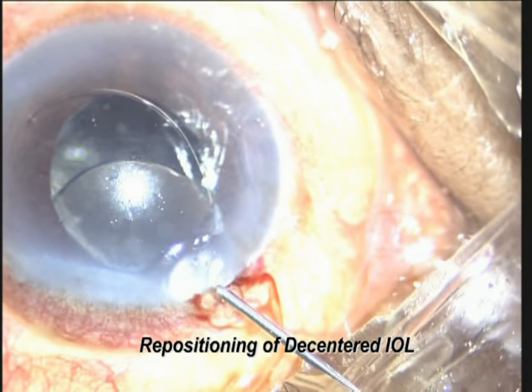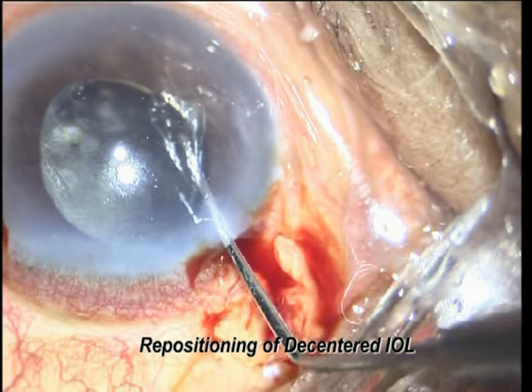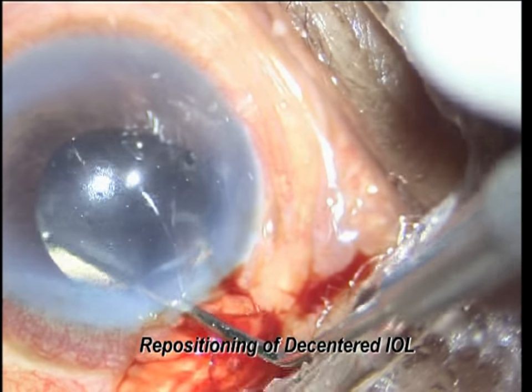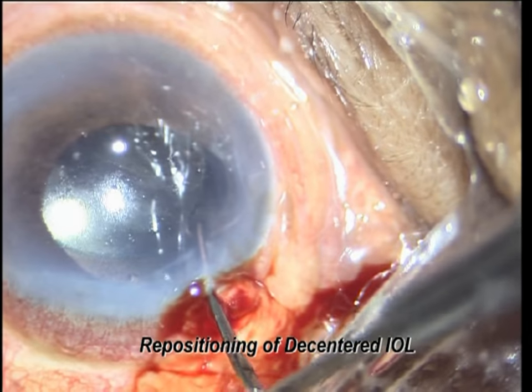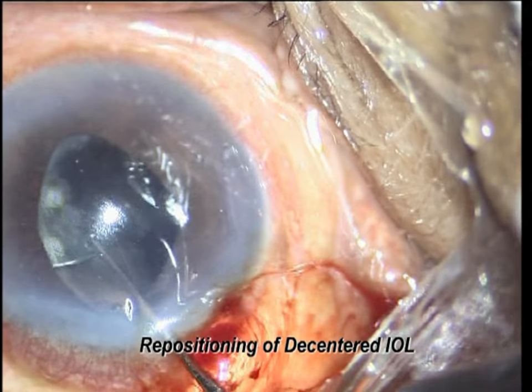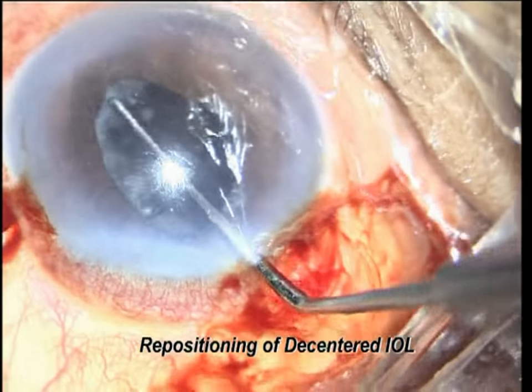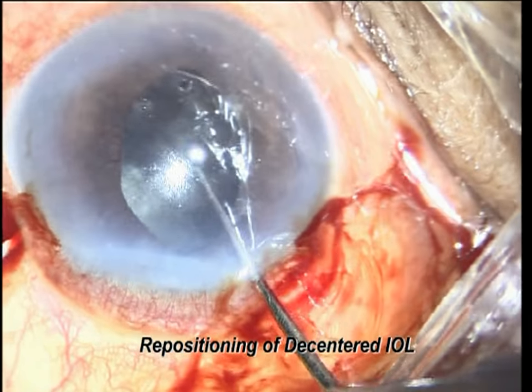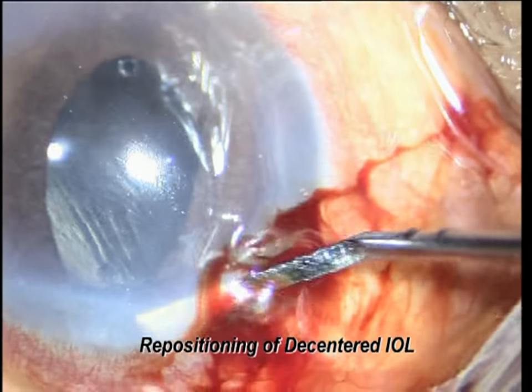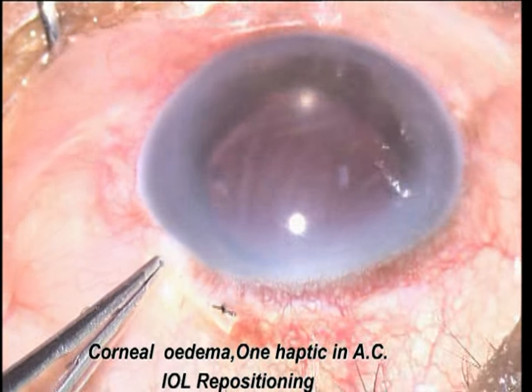This is another case where the haptic is touching the endothelium. You can see asteroid bodies. Use good viscoelastic. First assess that you have sufficient rim of anterior capsule where your haptic can get support. Now the bag lens has gone into the sulcus — center it. Separate anterior synechiae, wash, and perform anterior vitrectomy.